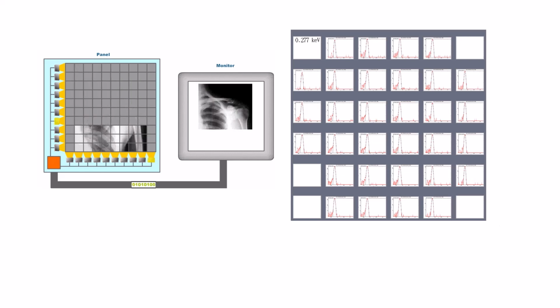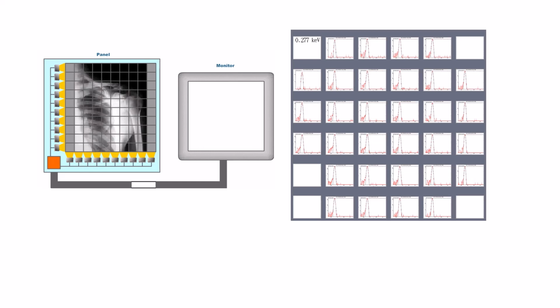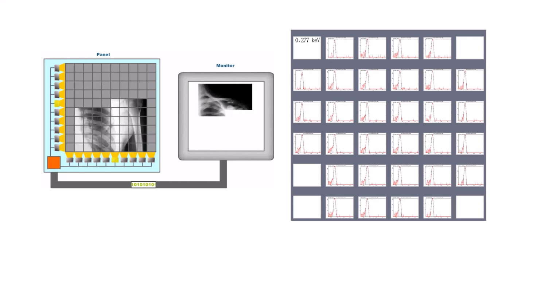This is a process of recording the analog energy received. The analog information received will be transferred in the computer and analyzed to create a numerical representation of the intensities. This is called analog to digital conversion. The computer then takes the digital data, and that can be utilized with computer programming to create the images we see on the monitor. This is called digital to analog conversion.